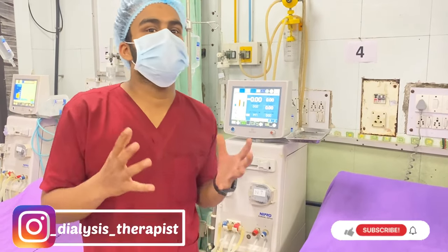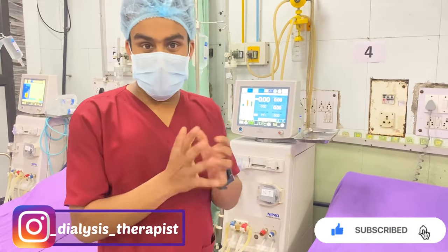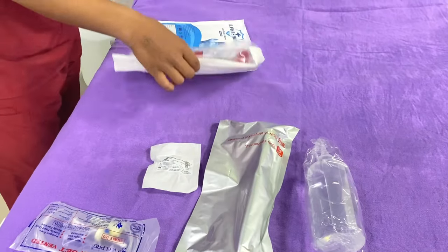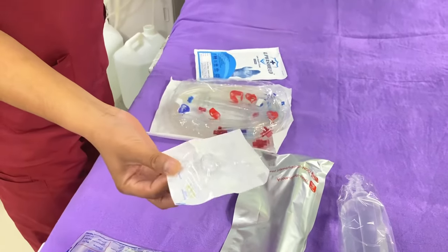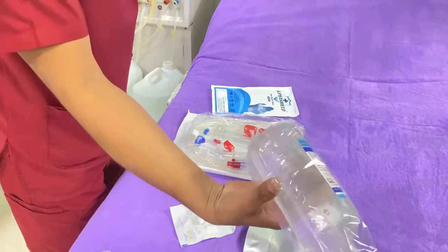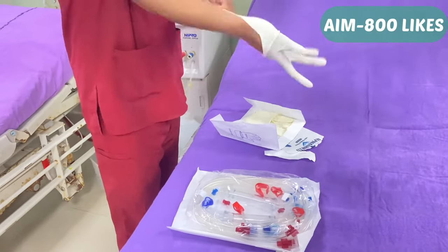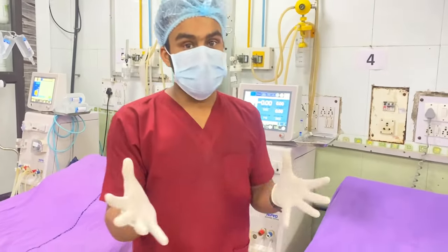Hello guys, this is Sujit Kumar, dialysis therapist, here in Delhi. In this video we are going to see how to prime a dialyser. Here are the items required for the dialysis procedure: this is the dialyser, this is the AV blood tubing, this is the TP transducer protector necessary for measuring venous pressure, and IV set, 500ml normal saline bottle, and surgical gloves. First we have to wear the surgical gloves, then take the dialyser.